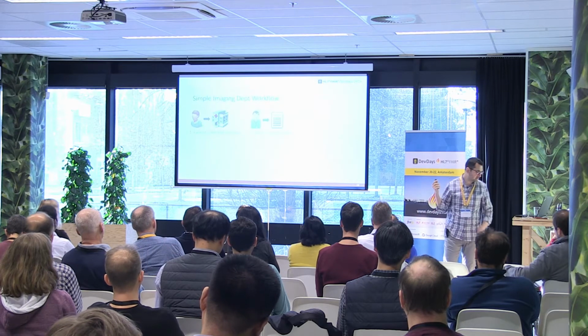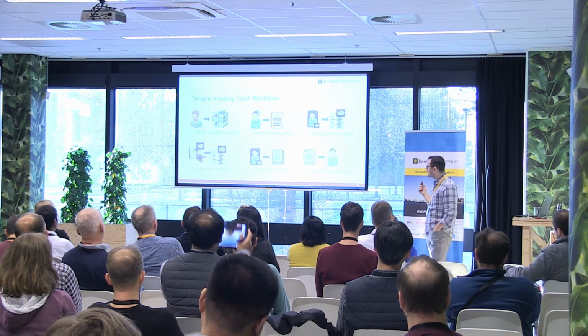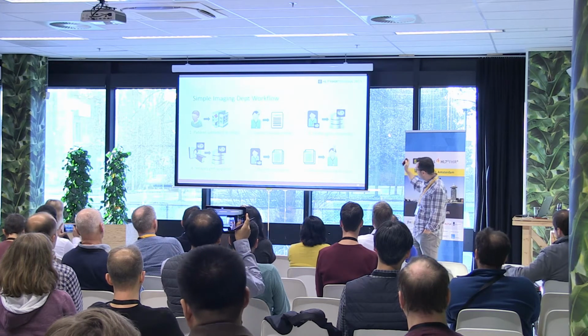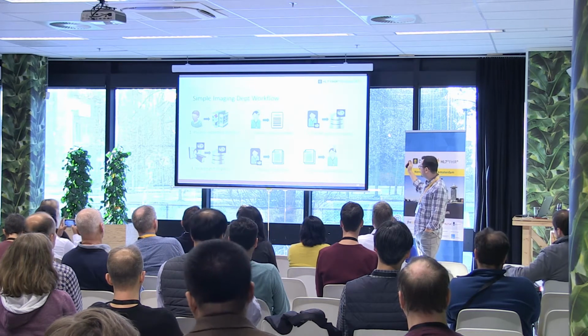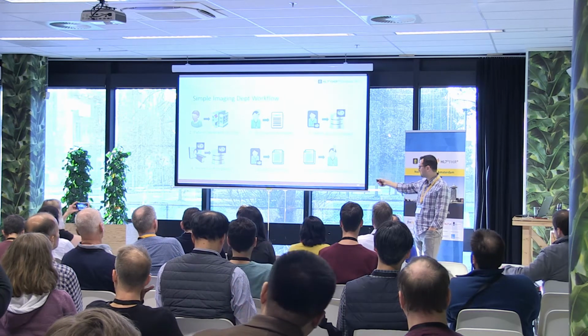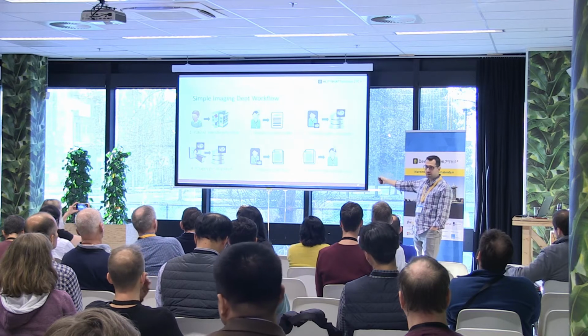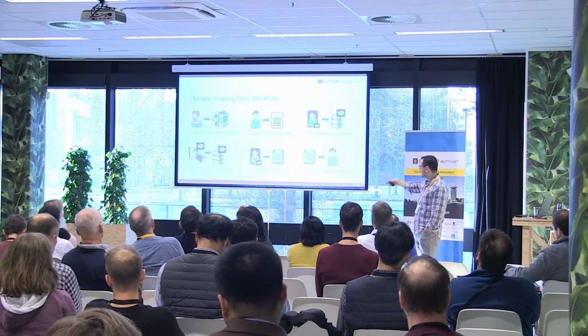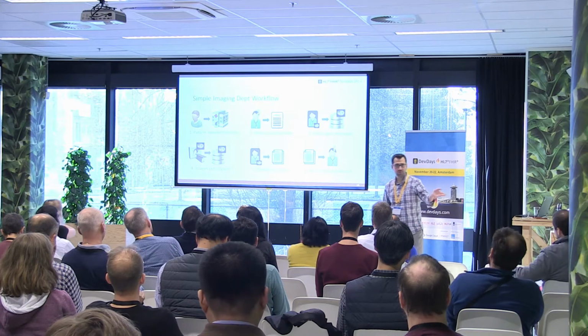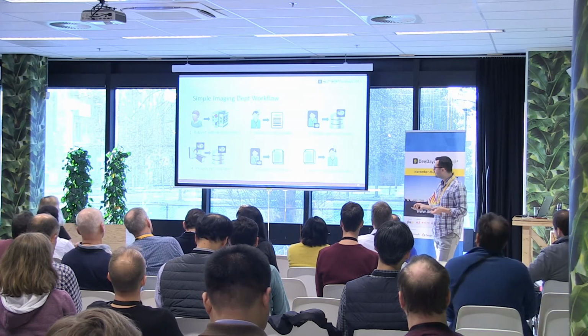So if we look at a sample workflow over here, you make it to a hospital or a clinic. The doctor creates an order. Your order is reviewed. The exam is actually performed, so the images are acquired. And then a radiologist somewhere would create a report, and then that report is distributed to your primary care physician, referrals, and so on and so forth.